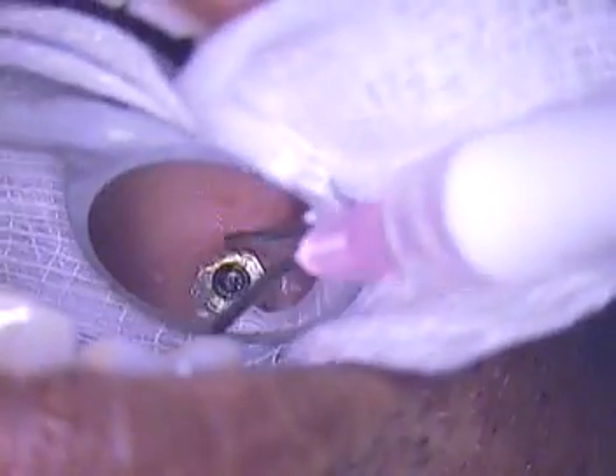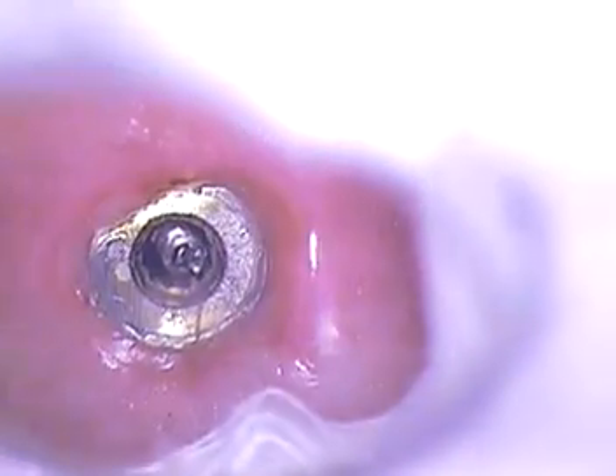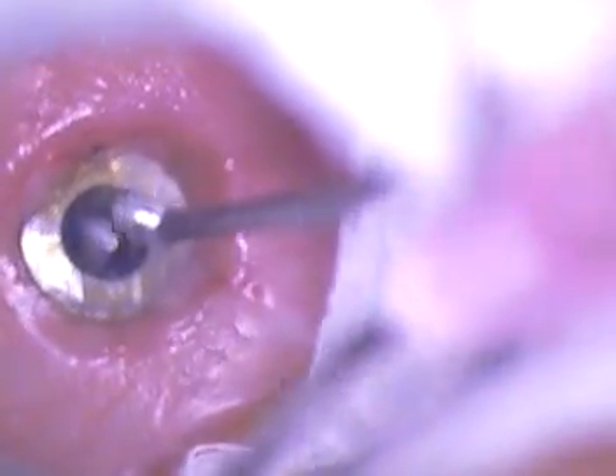We'll put this gauze first — always protect the throat. The patient is already informed; he's going to block his throat with his tongue. We'll go in, I'm just going to bring my suction tip in, open up a little bit wider, and we'll just grab it like that. There goes our screw, and now we have both out.